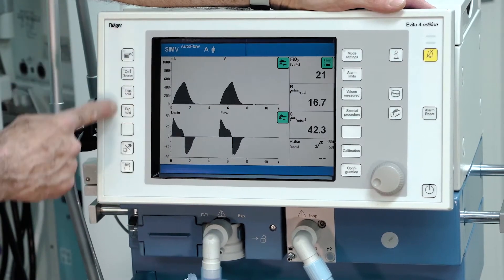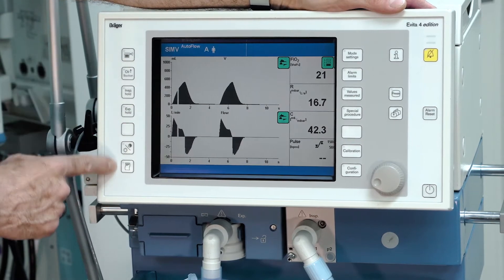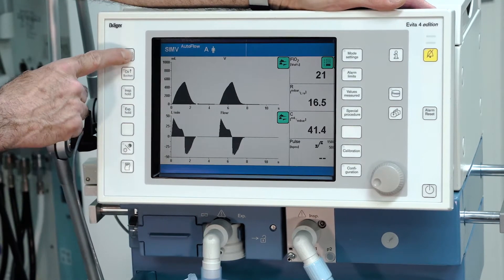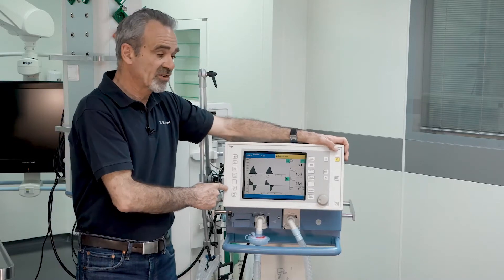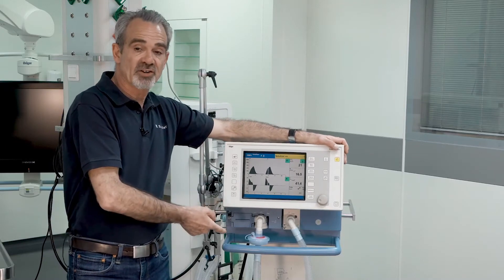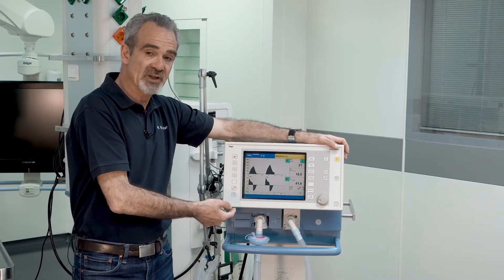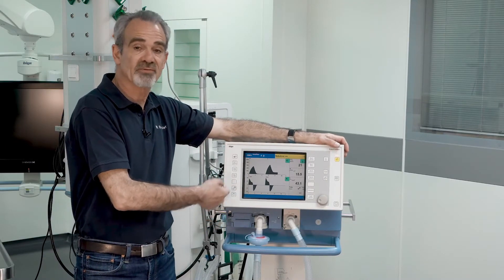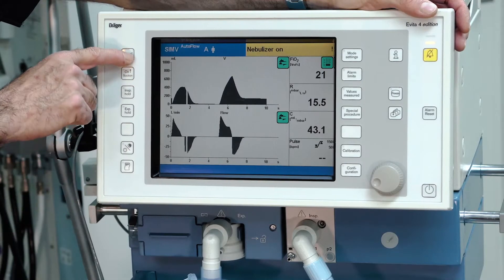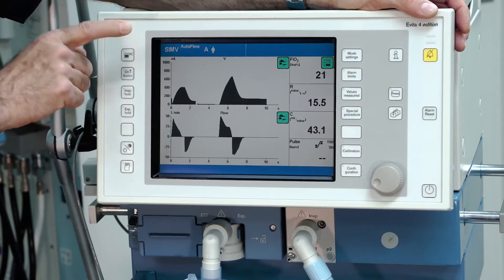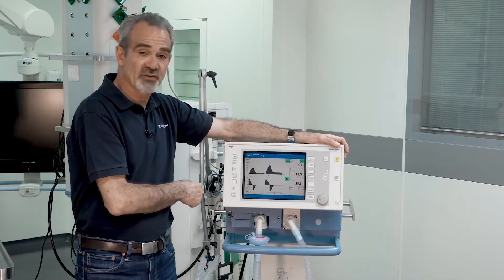On the left side of the screen, there are some fixed keys. With the first one, you can switch the nebulization on if you require nebulization and have connected a nebulizer. By pressing the button again, nebulization is finished.